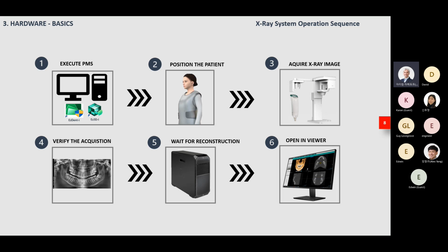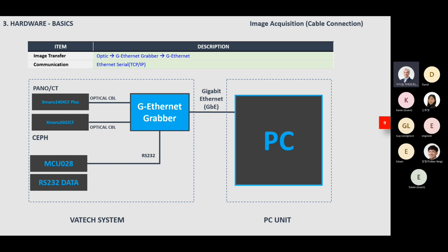Okay, thank you. So later you can verify the acquisition after acquiring the image and wait for reconstruction, which will go through inside the PC, and then you can open it in the viewer and view the image itself. So all these 6 simple steps from acquisition to viewing the image.